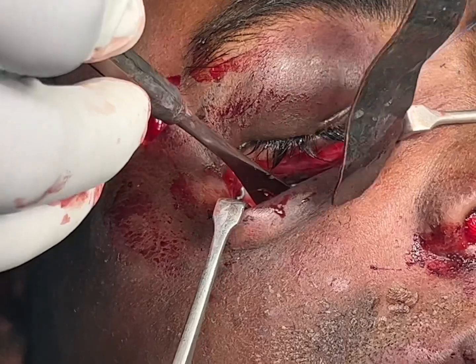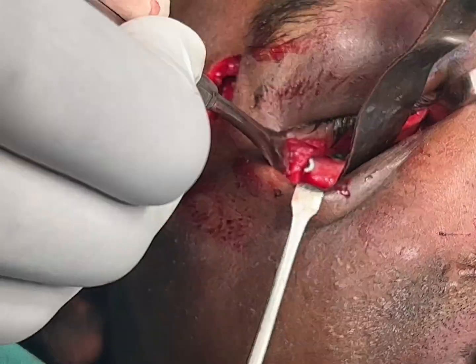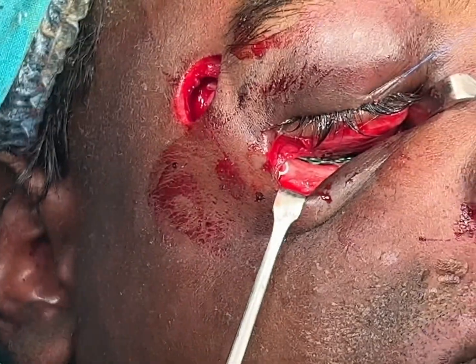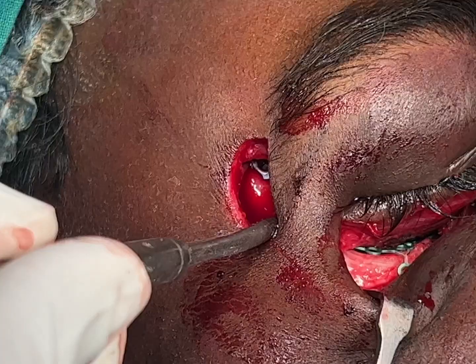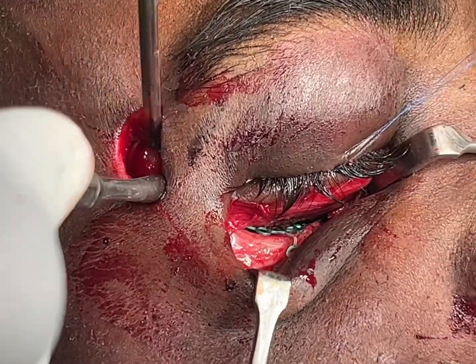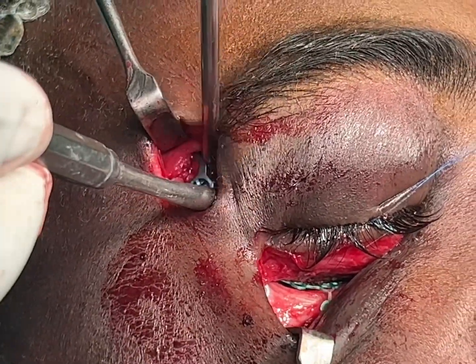Once that's done, I just have to put a screw here — one screw each, but sometimes just one screw will suffice. We've also used a frontozygomatic approach, as you can see. This has already been fixed — it's a larger plate and a larger screw.